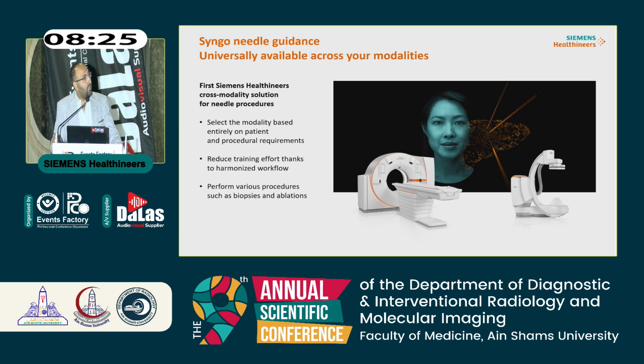Like in CT, we don't have live images. We only have static images, so we take a lot of runs to navigate our needle. And also the dose in CT is triple the dose of normal fluoroscopy.